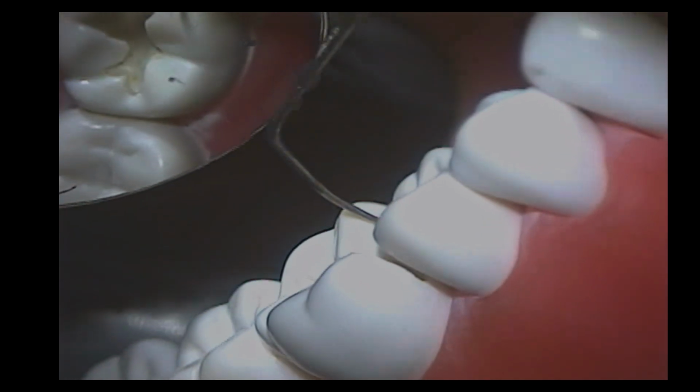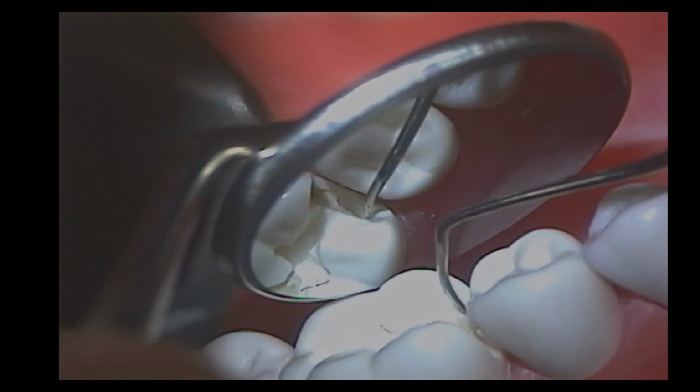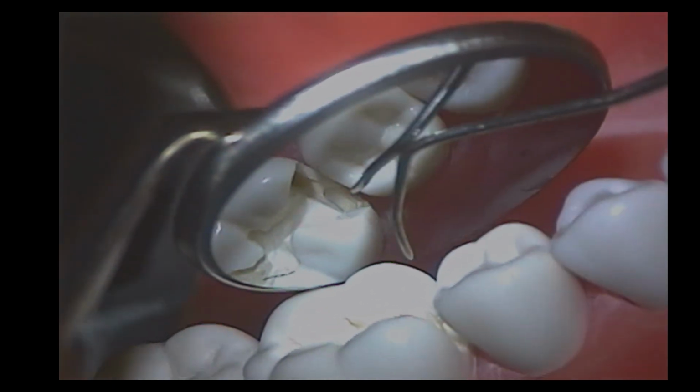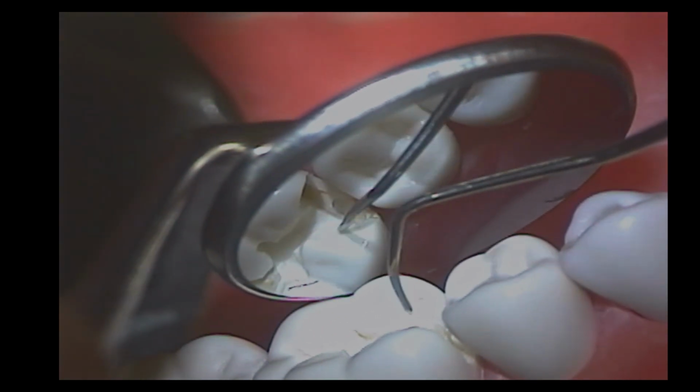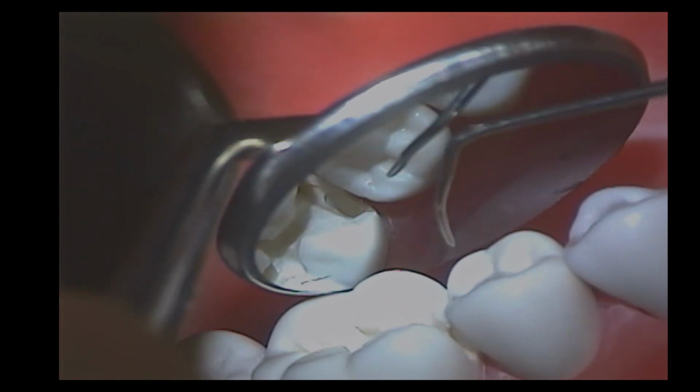Instead of being vertical, it's diverging, but the gingival part of that wall is actually converging, which is what we would normally prefer. But everything along here is diverging occlusally, and that makes the wall more complicated.